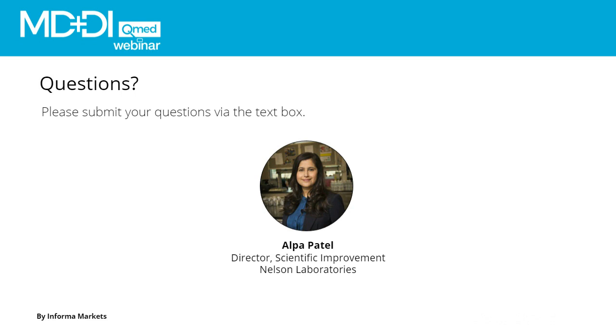So you have to do some sort of R&D test, either internally or with a third-party laboratory, to establish the life of your product. Manufacturers have to know when the device is no longer usable, and they have to notify the users through the IFU when it's no longer usable, and you have to either throw it out or contact them for a replacement.